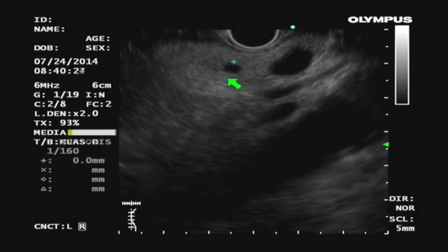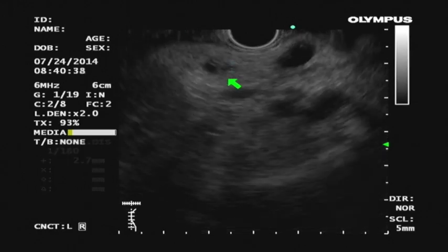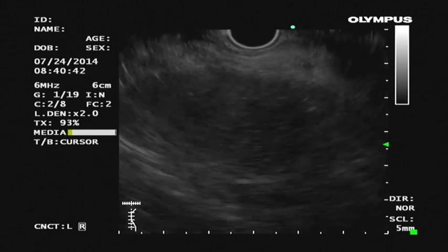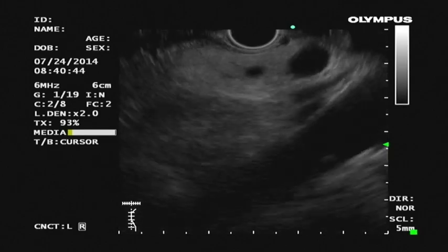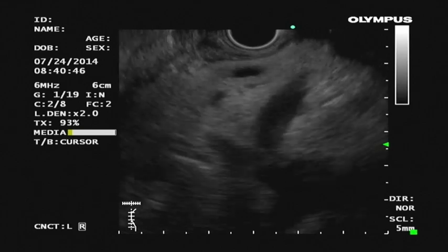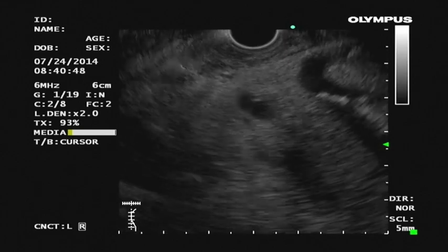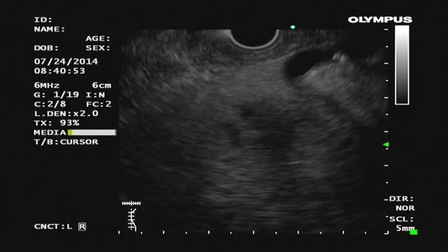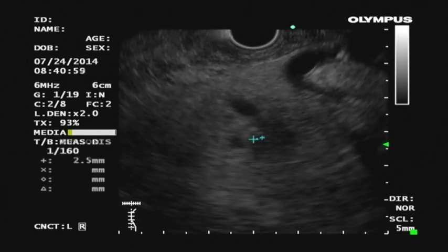The pancreatic duct was of normal caliber for her age in the body and tail of pancreas, and the parenchyma appeared normal. As the duct was traced towards the neck of pancreas, it became ectatic and dilated, and the surrounding pancreatic parenchyma was more hypoechoic than the adjacent tissue. A mural nodule was seen within the dilated duct, as well as the dilated side branch.